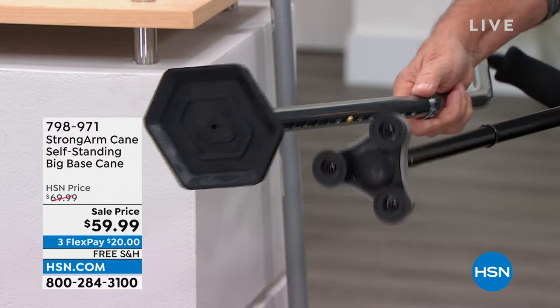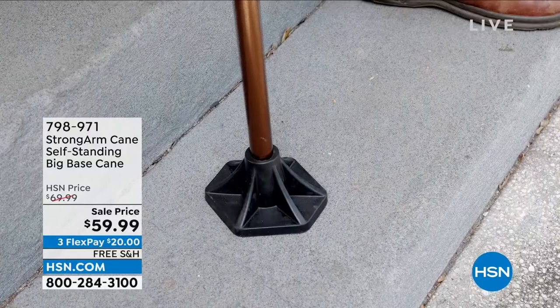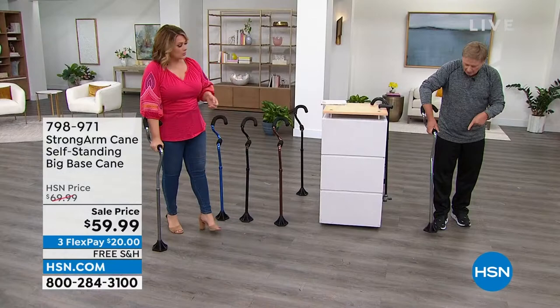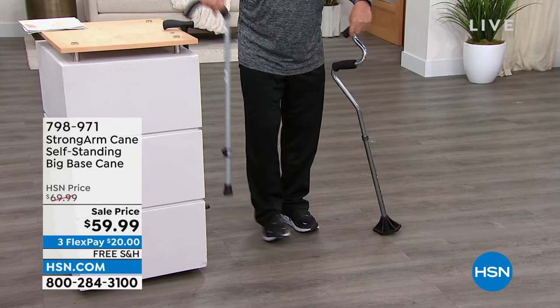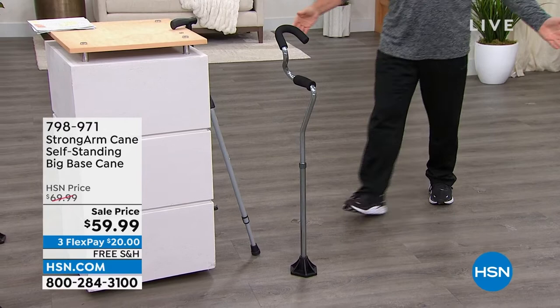That's important because not only is it going to give you stability when you're using it, but if you happen to be out and about and want to put the cane down, a regular cane is difficult to find a place to put it. This is going to stay upright — it stands all by itself because of that large base. So that base gives you both stability and balance.